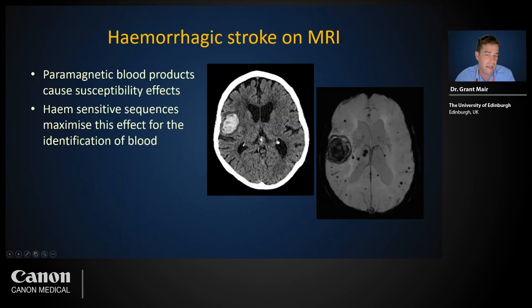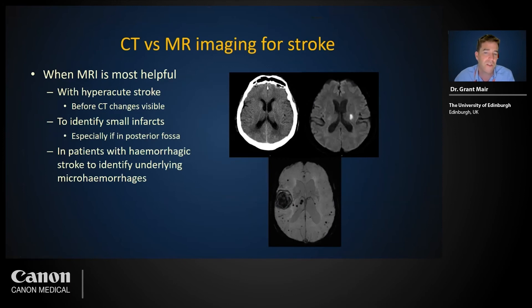Heme is slightly magnetic, so hemorrhage-sensitive sequences on MRI take advantage of this property to provide imaging highly sensitive for blood products. In addition to a large acute frontal lobe hemorrhage, note the many chronic micro-hemorrhages in this patient with amyloid angiopathy — these are not visible on CT. Therefore MRI is especially useful when we need to identify hyper-acute changes not yet visible on CT, changes too small for CT, and to identify micro-hemorrhages supporting a diagnosis of amyloid angiopathy.